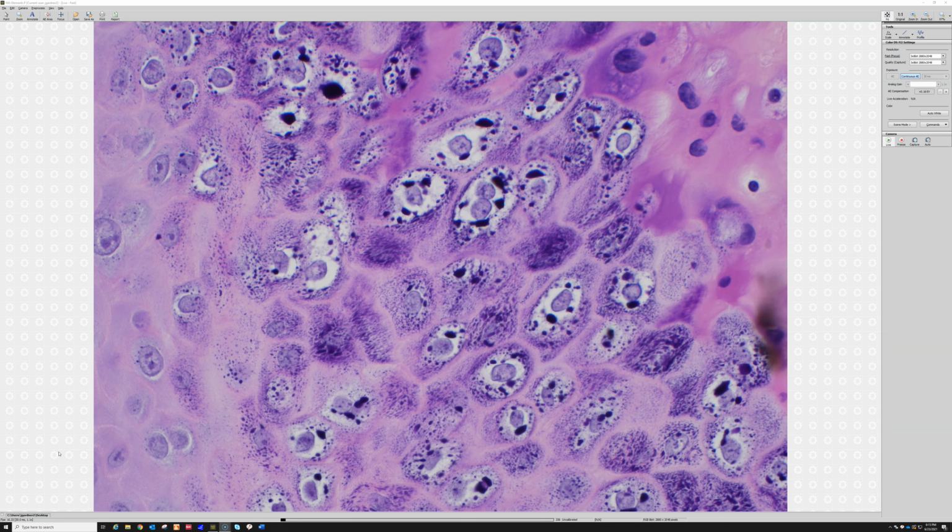If you learned in med school, they talk about koilocytes seen on PAP. On the PAP test, formerly known as the PAP smear, which is the cervical exam to screen for cervical cancer, which is caused by a different subtype of HPV than what causes verruca vulgaris, but HPV all the same. So HPV looks very different to me on a PAP, which is prepared differently than an H&E section of formalin-fixed tissue, which is what we're looking at here.